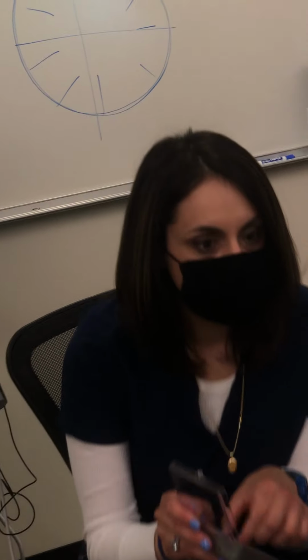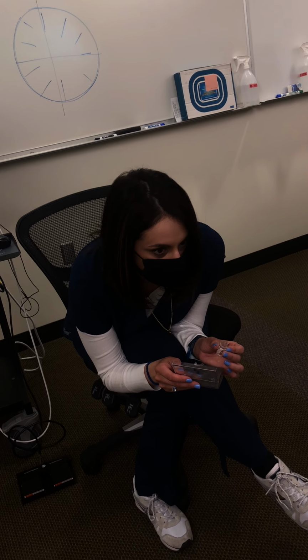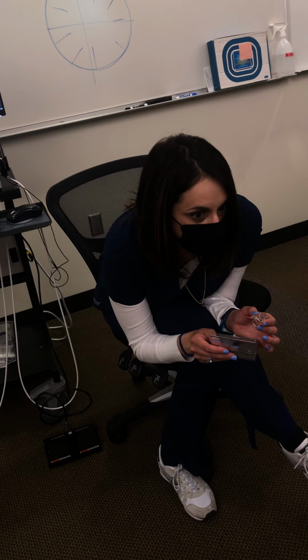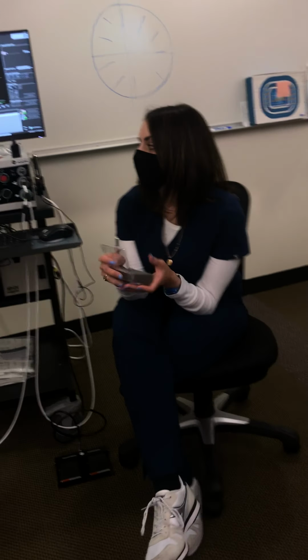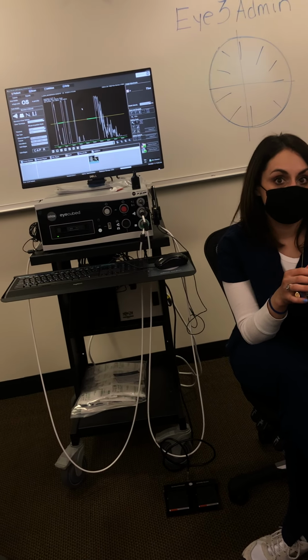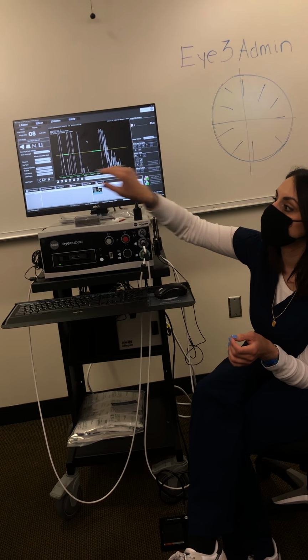Really great resource. I'm scared of that one when I try to do it on one of my classmates. I freak out because I feel like I'm going to pop the cornea. I know. I've actually seen a corneal perf. We're not doing this in class.